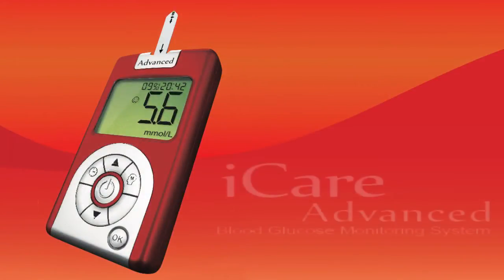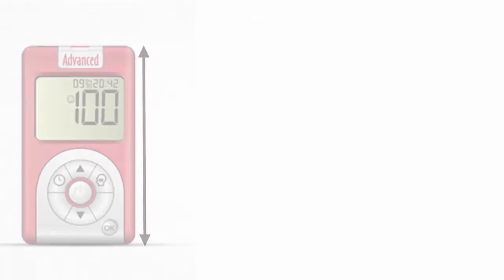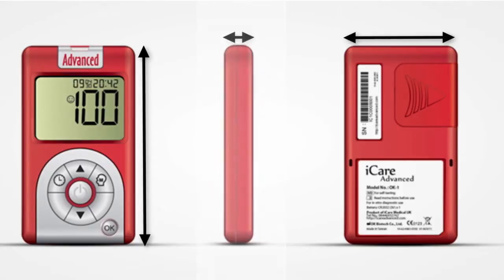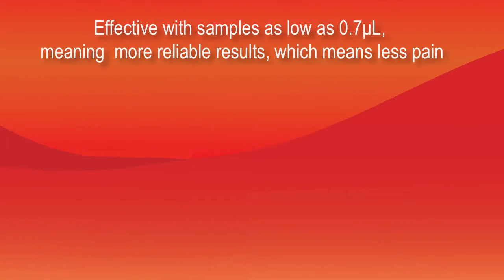The iCare Advanced Glucose Monitoring System, developed with the help of doctors, scientists and engineers, makes it easier to self-test your blood glucose levels. It features state-of-the-art precision glucose oxidase testing technology that is 97% as accurate as hospital equipment, yet convenient for everyday use. The iCare Advanced Meter is effective with samples as low as 0.7 µL, meaning more reliable results and less pain.